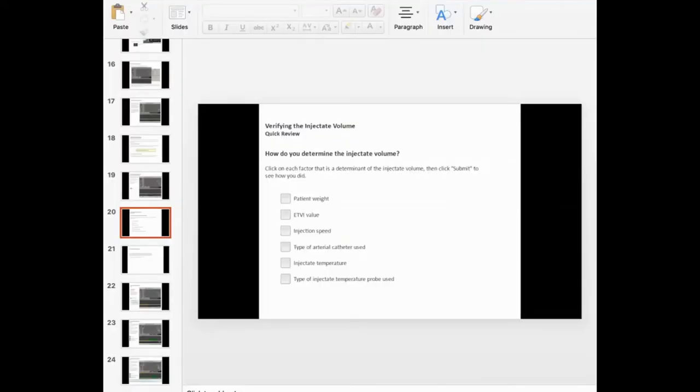Like I told you earlier, how we derive PiCCO is using a technique called thermodilution. So first of all, we have to inject a known temperature of cold saline into the CVP line of the patient. And then we have to set up the femoral arterial line of the patient. There are a lot of PiCCO catheters; you can insert the PiCCO catheters femoral, brachial and everything. But what we most recommend is the femoral arterial line, because that gives you a more accurate reading than other methods. So here you can see this is a femoral arterial catheter.